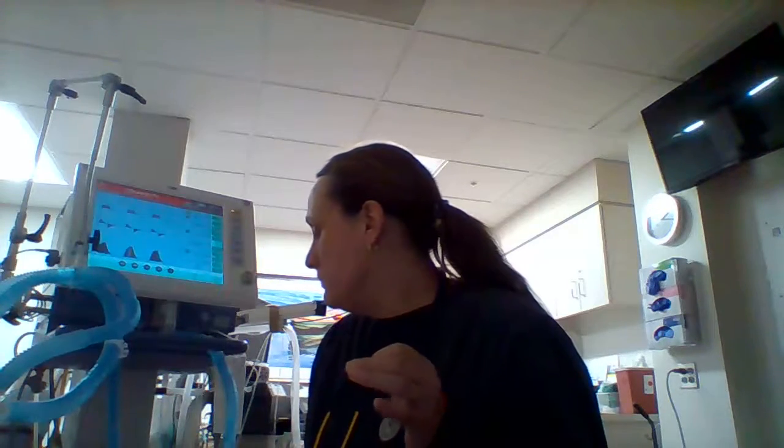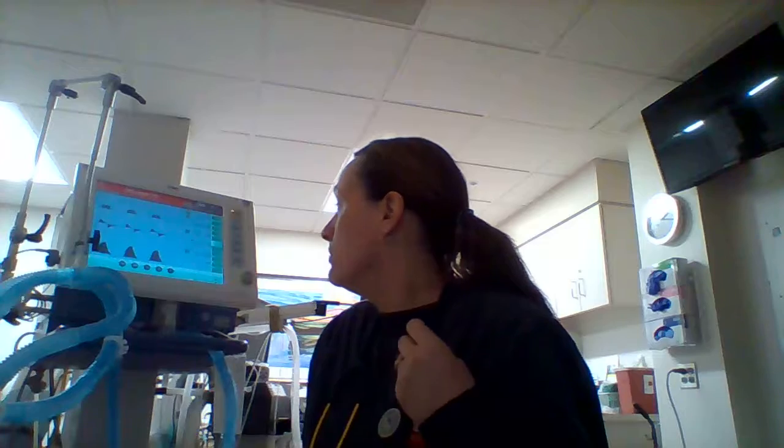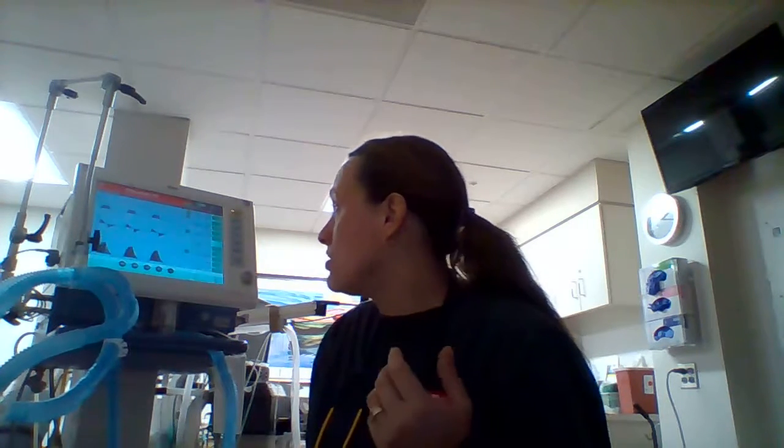Alrighty then. So we're assuming this is a closed head injury. Do all the normal stuff you do for every patient. Check their vital signs, their heart rate, their blood pressure. Do an arterial blood gas and see where you are to start with. It may be normal to start with because nothing's had time to go wrong. Send them for a chest x-ray to verify the placement of the tube, do the CT, all that good stuff. Look for swelling in the brain. Verify your cuff pressures.